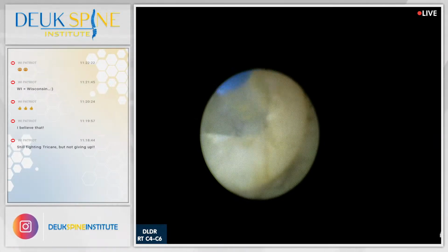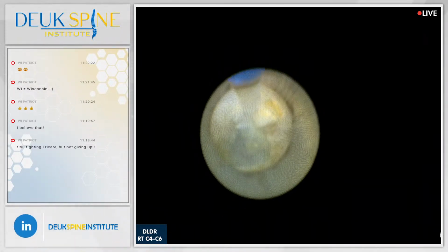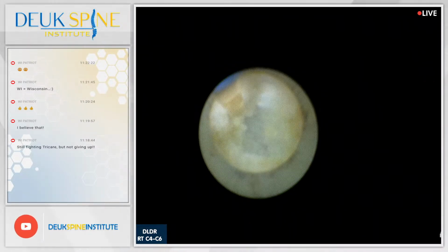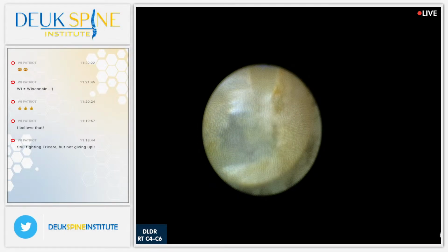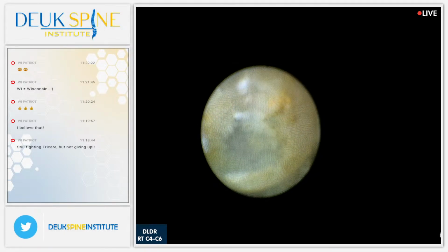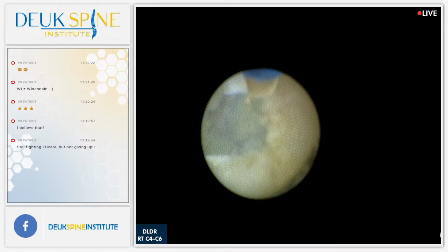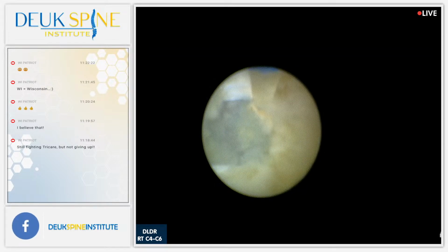Remember, underneath this is his spinal cord, so I could feel his body moving, not because the laser's hitting the spinal cord, but because there's a pulse wave, and because he's not chemically paralyzed anymore. That's why I'm feeling his muscles twitch. It's pretty amazing, isn't it?